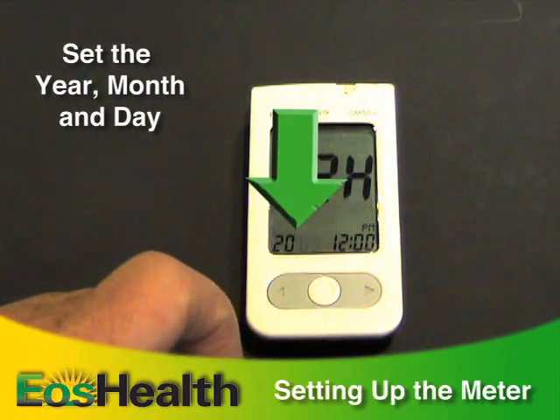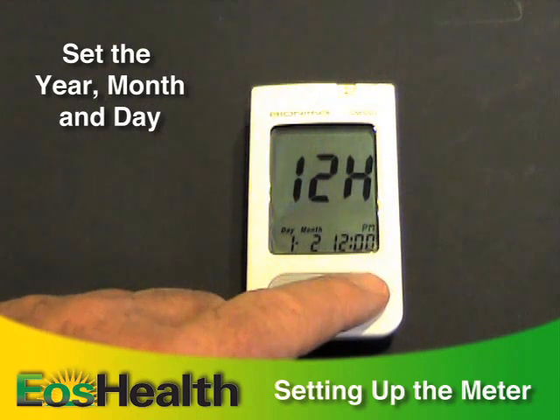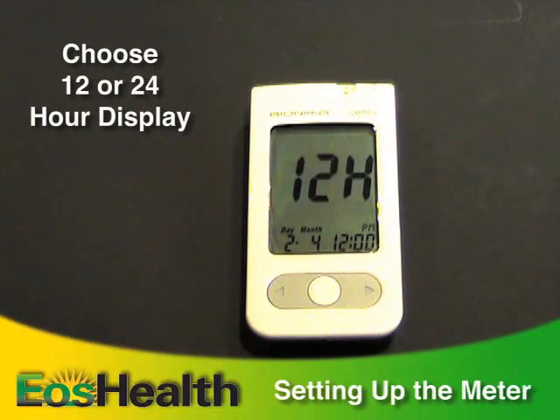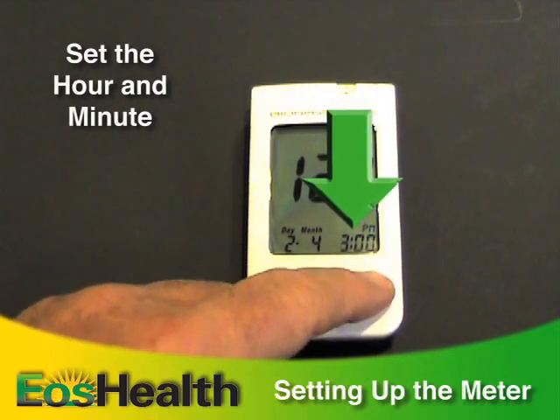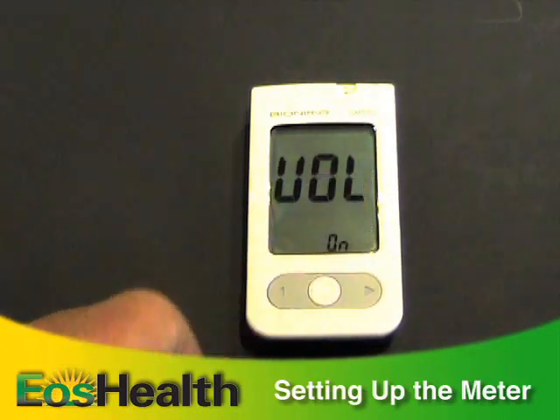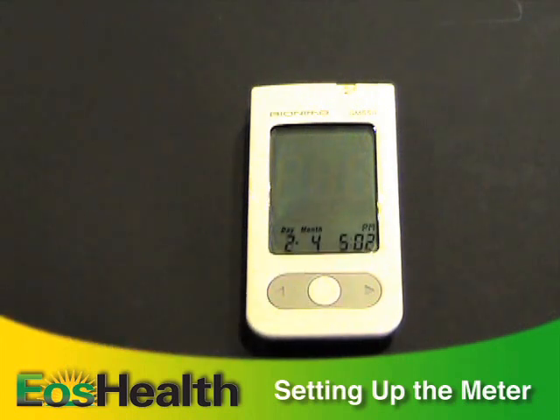Press and hold the main button until the year digit flashes. Press the left or right arrow button to change the year, then press the main button to confirm. Next, set the month and day. You can choose either a 12-hour clock or a 24-hour display, then set the hour and minute. It's important to enter the correct time so we know the time of day for your readings. You can also turn the meter volume on or off.